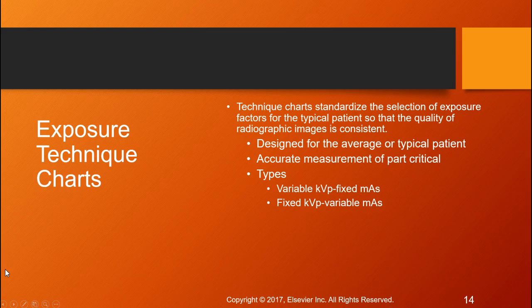Okay, consistent in the fact that if you have the same size patients, you can use the same technique to get very consistent radiographs for your radiologist. Or if you have the same patient come back a different day with a different technologist, you're using the same technique chart in the same room, and you're going to get a very comparable radiograph, okay?